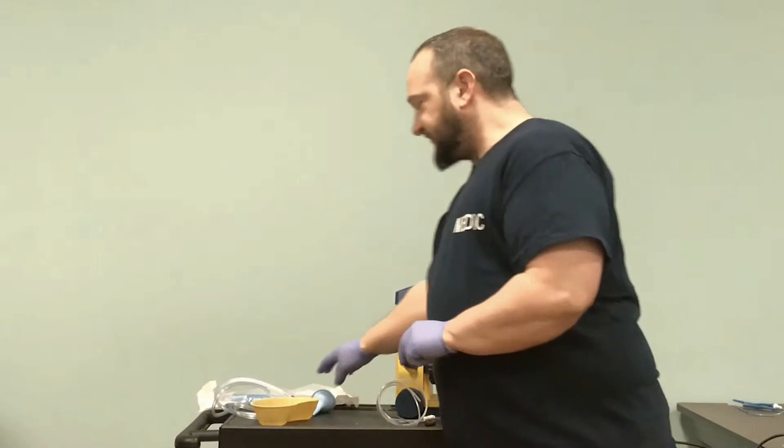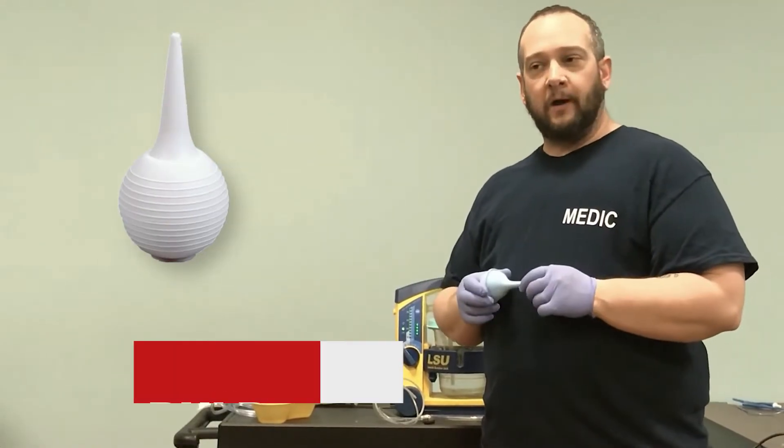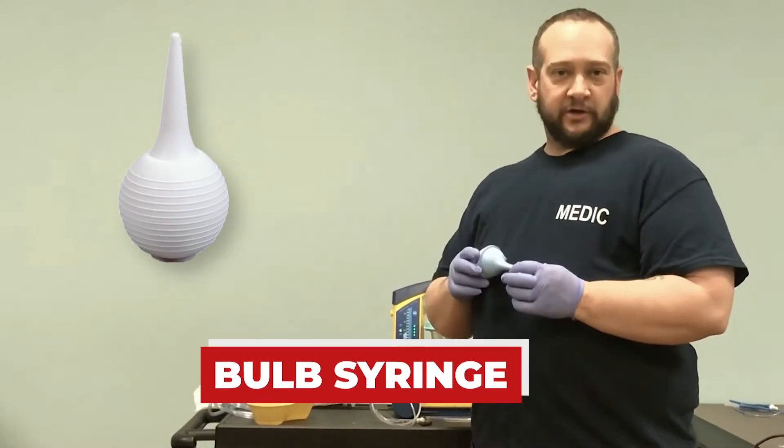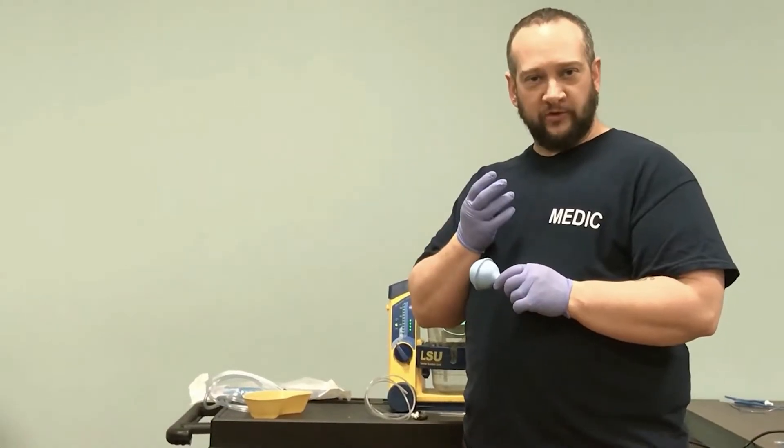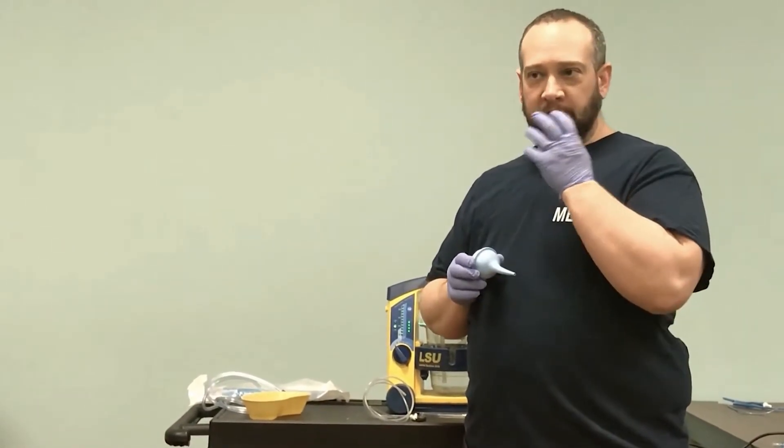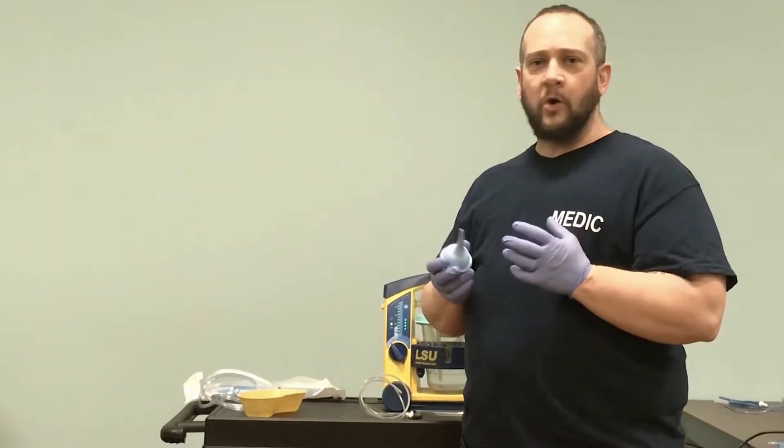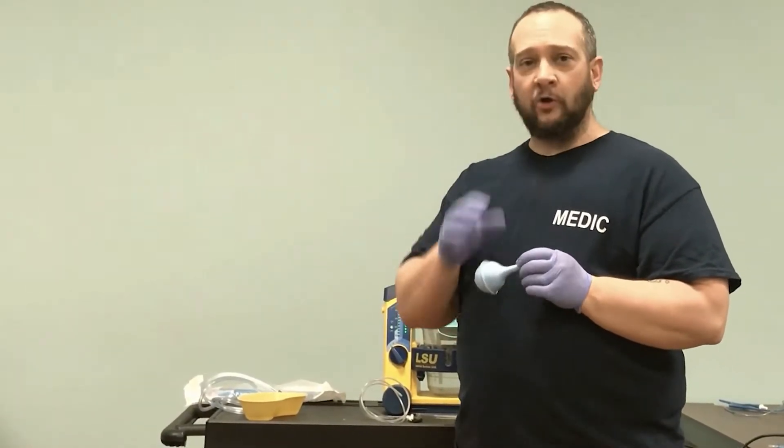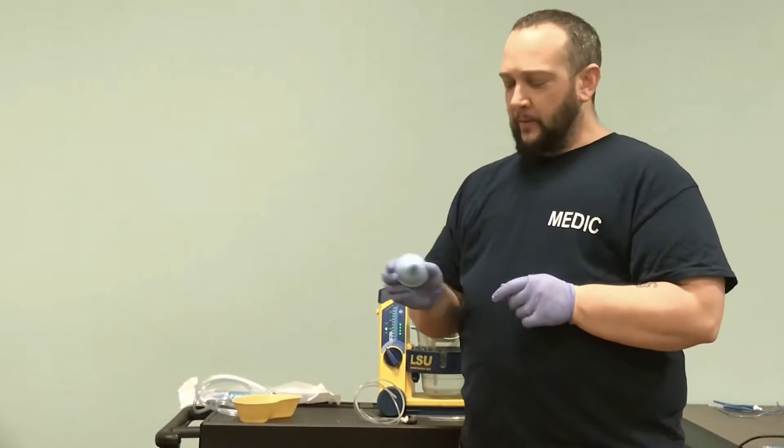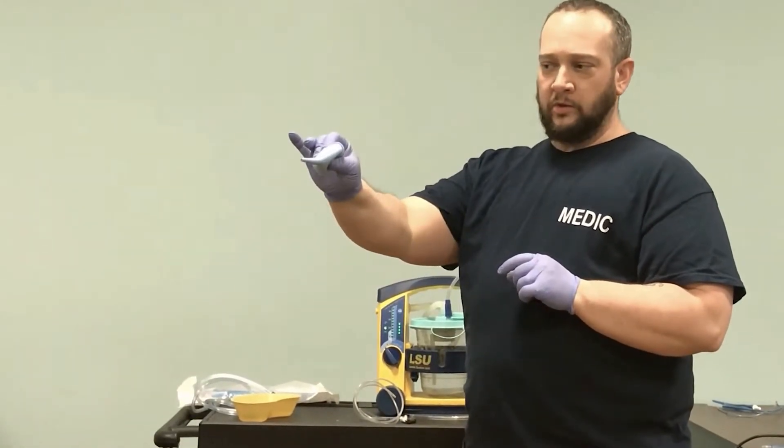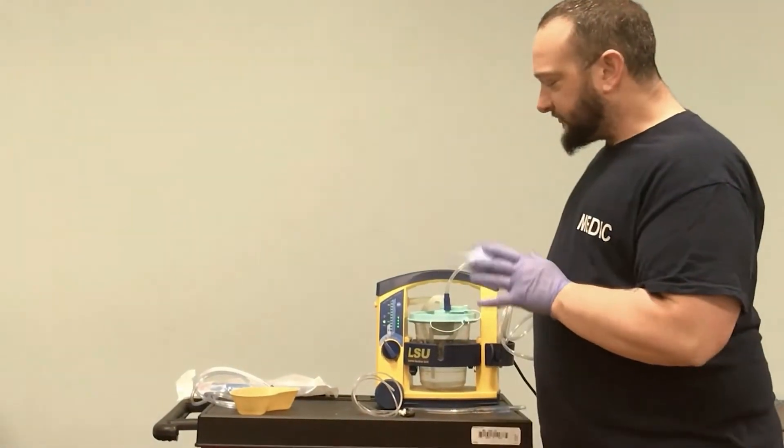For infants and newborns, we also have a bulb syringe for suctioning. We'll talk more in our OB section—we no longer immediately suction upon birth. But often infants and young kids are obligate nose breathers, and if they get a nose full of dried mucus, it interferes with their ability to breathe. We may have to demonstrate for new parents how to use the bulb syringe. You squeeze it, insert, and it suctions, then we discard it.